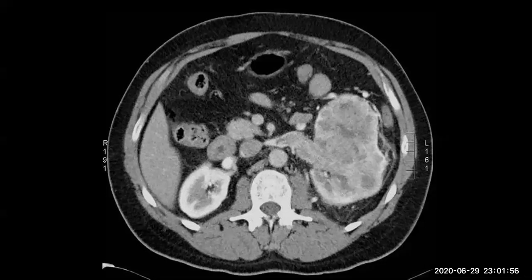It seems it could be pyelonephritis. Differential diagnosis maybe xanthogranulomatous pyelonephritis. I want more description. I can appreciate maybe a filling defect in the left renal vein.